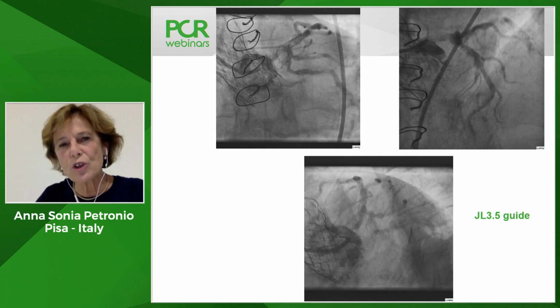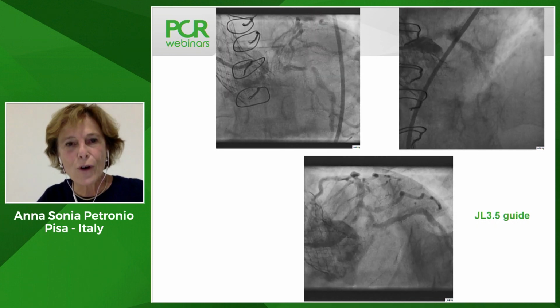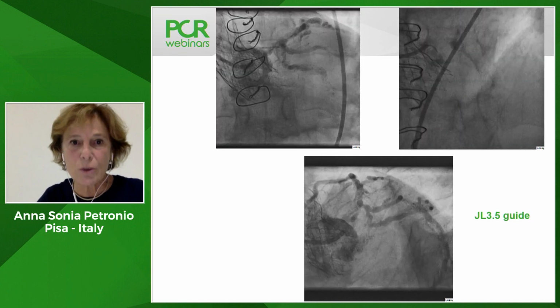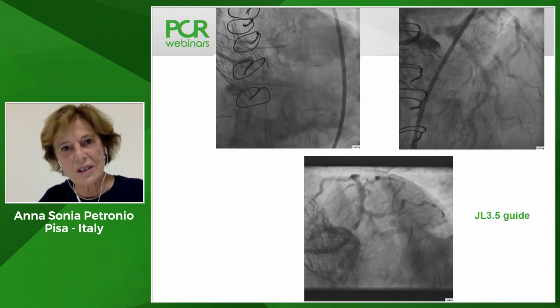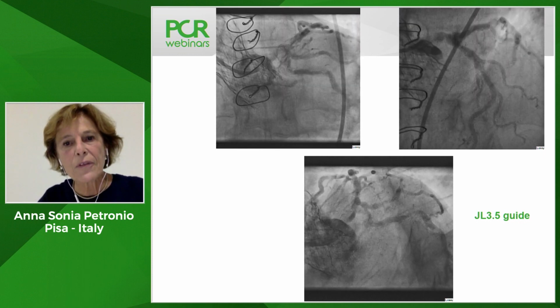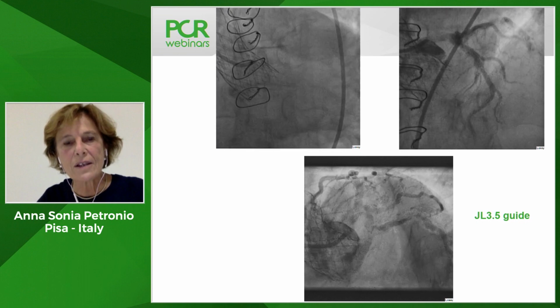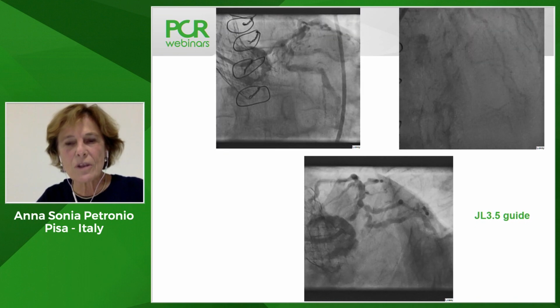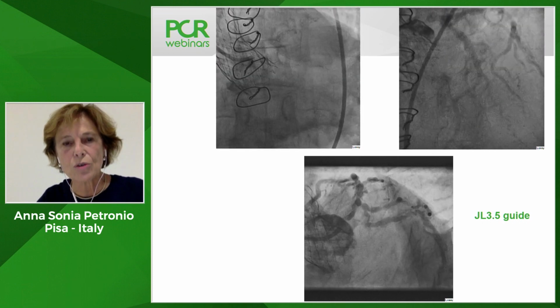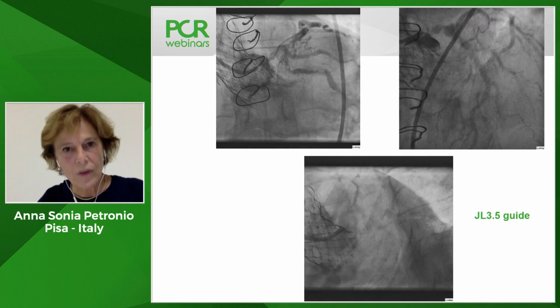We generally choose half a measure less for a CoreValve in respect to an Edwards, because the space is definitely shorter. But is there something else, like a particular wire or technology that gives you more advantage when you are not able to directly cannulate the coronary ostia with the guiding catheter?